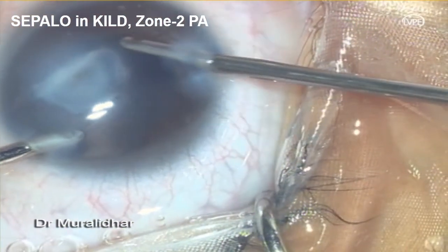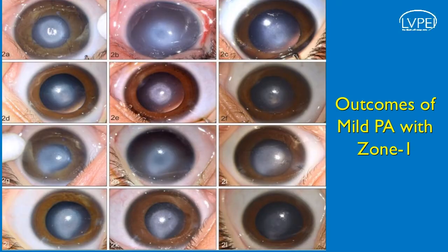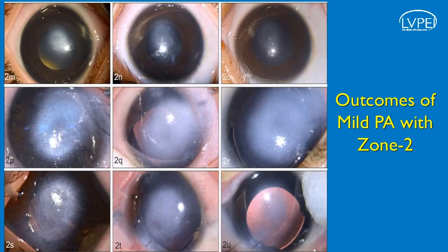The sequential picture collage of a milder variant of Peters anomaly, right and left eye of the same child, shows the postoperative corneal edema resolution with scar remodeling as observed over an 18-month period. In contrast to the top row, which had an extremely good outcome with a smaller zone of corneal involvement, the bottom two rows had a wider zone of corneal involvement that resulted in a suboptimal outcome following this intervention, observed over a period of 6 months.